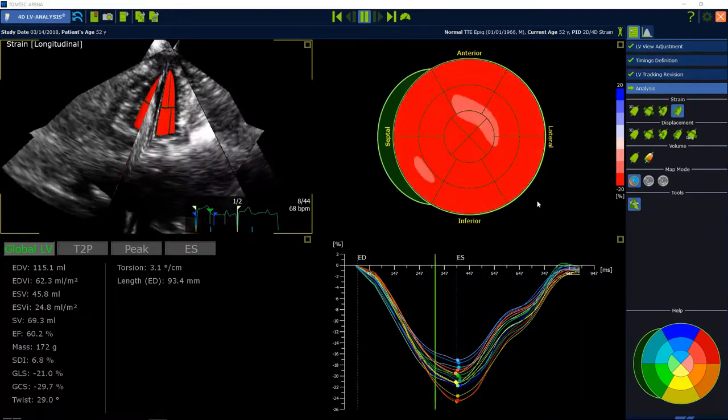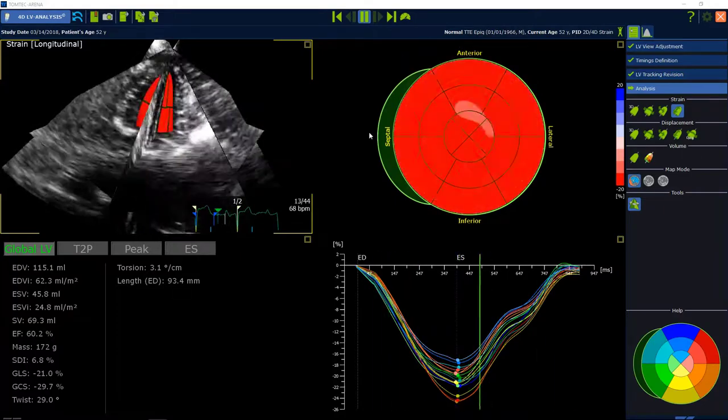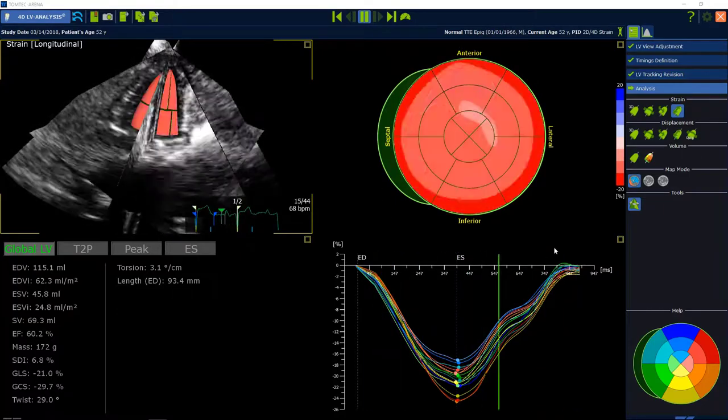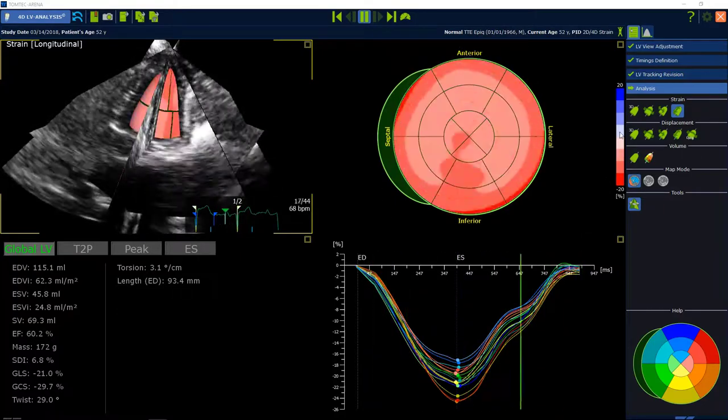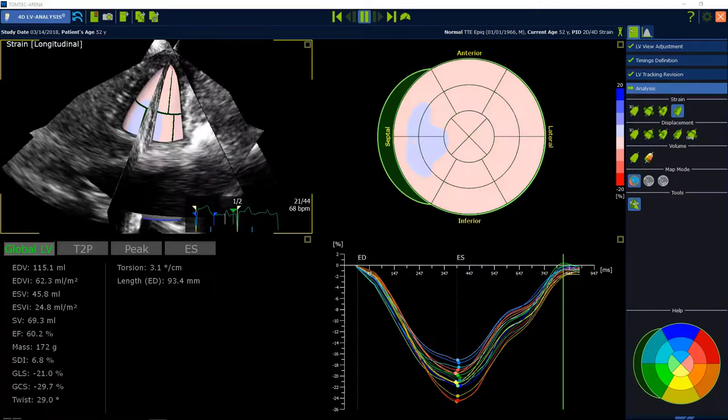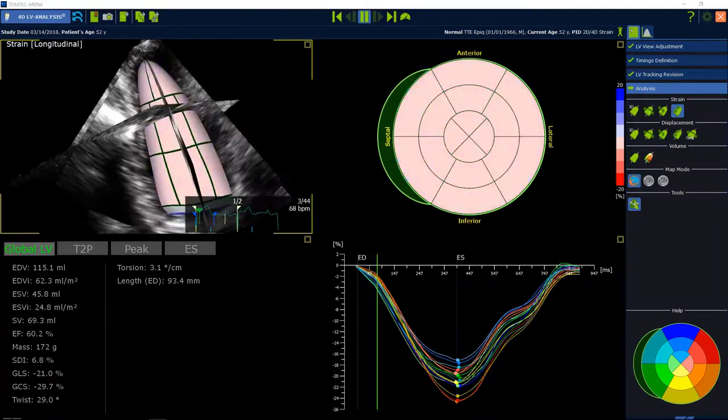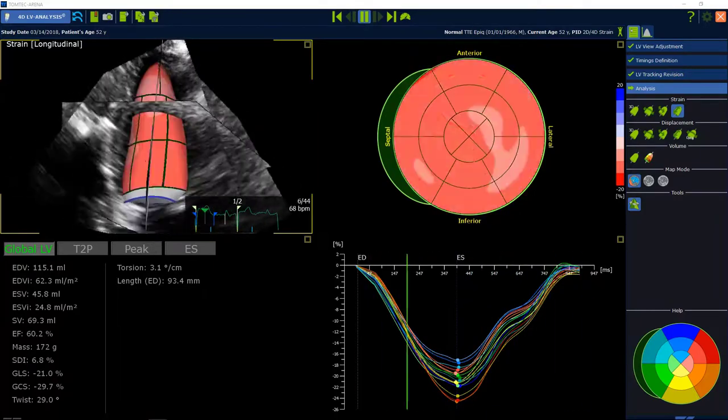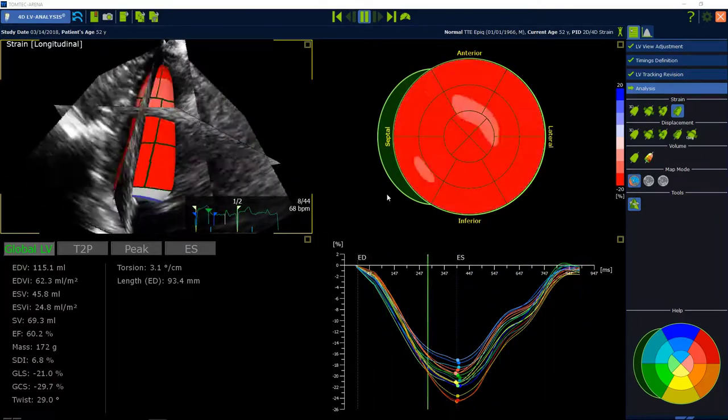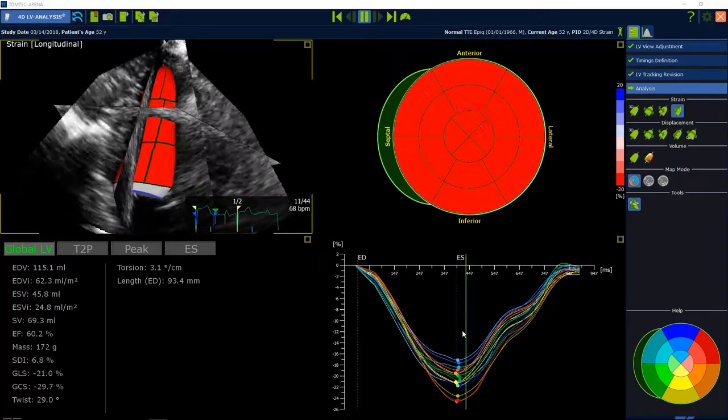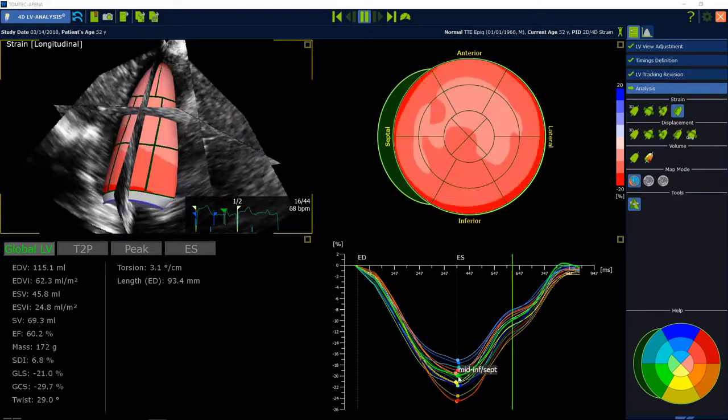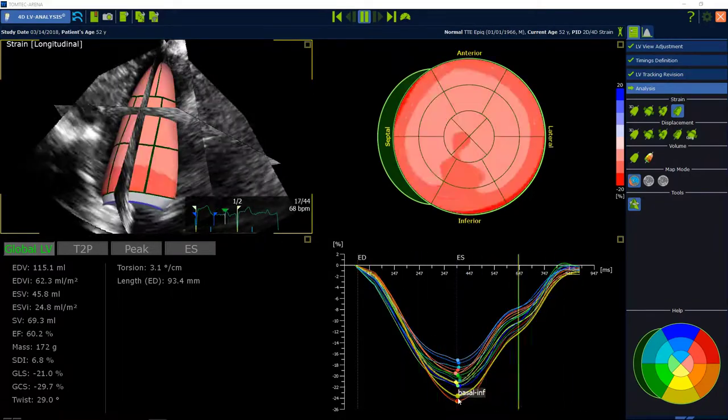On the right upper hand corner you can see the running bullseye with a color based orientation on the right side. You can see this color also displayed in the running model on the left side. And on the right bottom you can see 16 segment curve with a description.